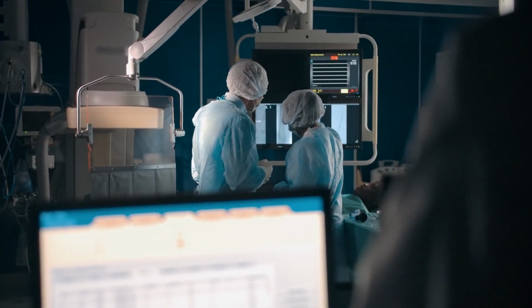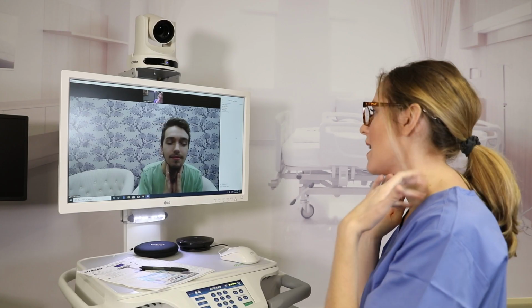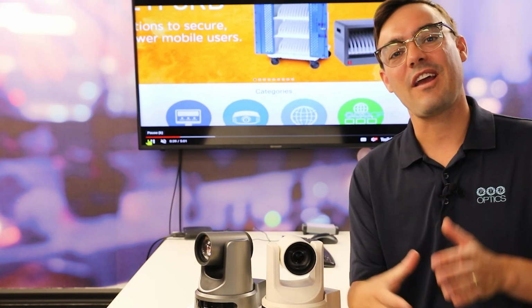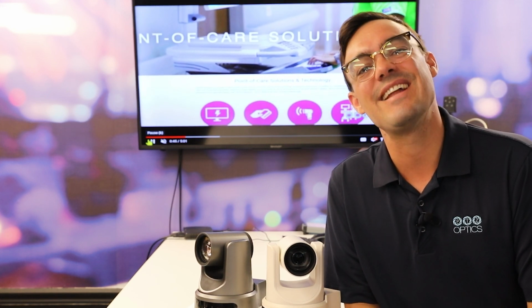The increasing need for educational video and instructional technology makes video systems like this a critical tool for many organizations. We hope that was a helpful overview of some of the various options for building surgical video recording systems with some of the latest audiovisual technology.